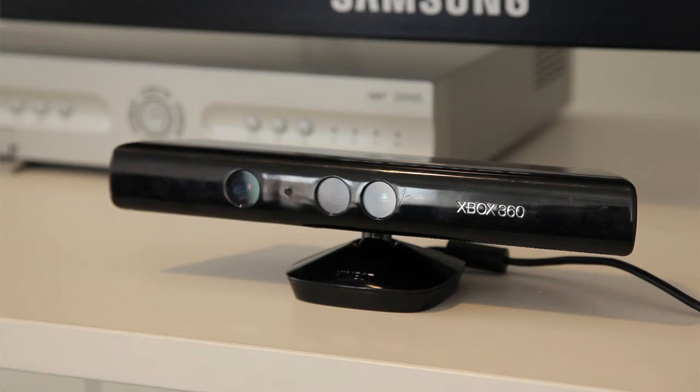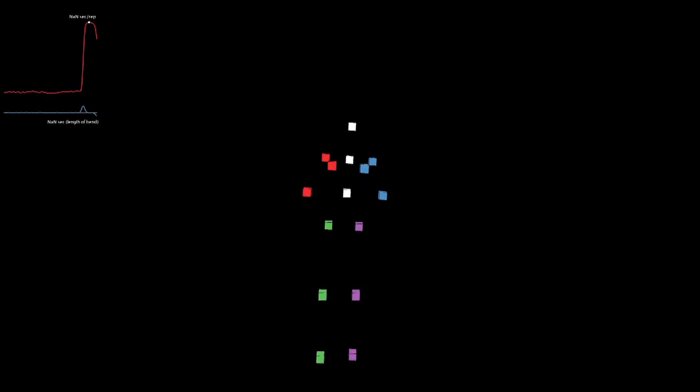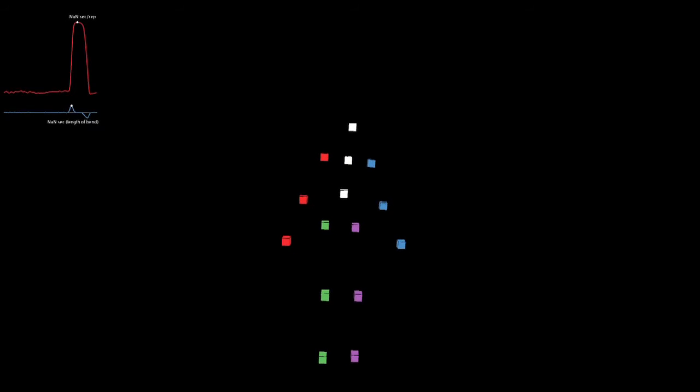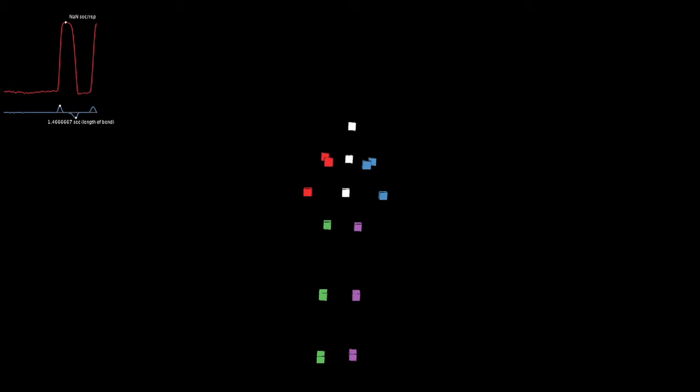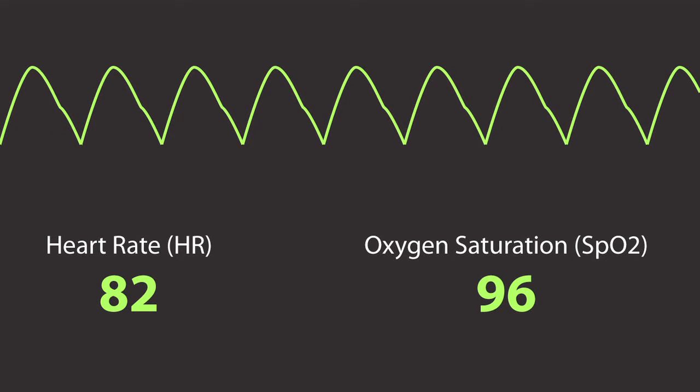The system uses Microsoft Kinect hardware and open-source computer vision algorithms to track and quantify patient exercise performance. It also uses physiologic sensors to track heart rate and blood oxygenation.